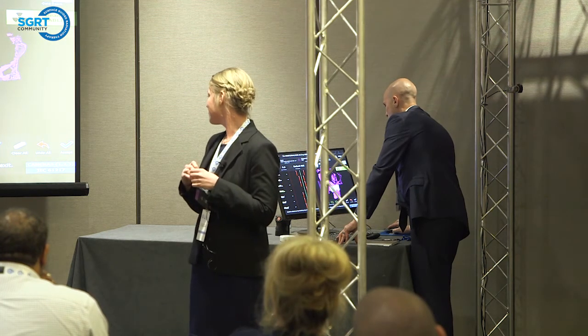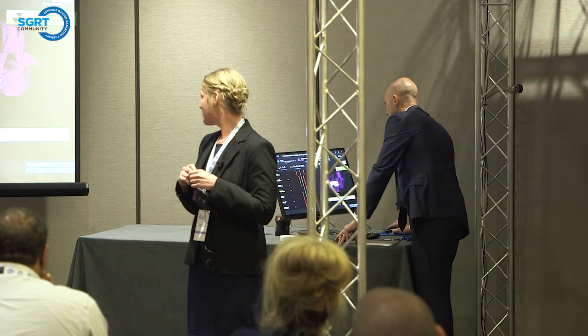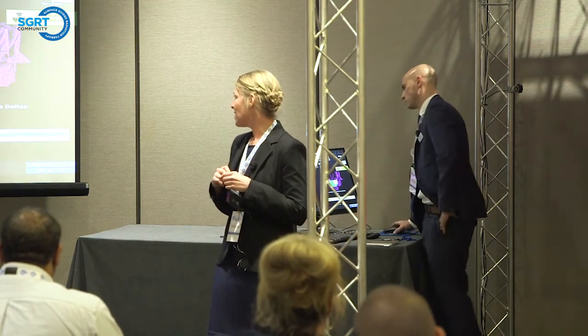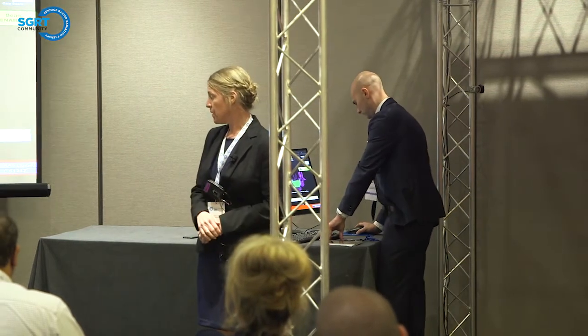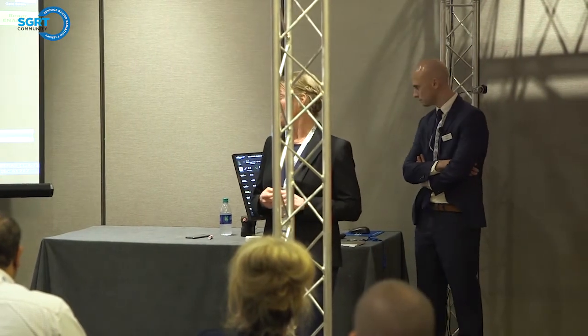Let me fix that region of interest really quick, just following my region of interest rules. Just make sure that everything looks okay. Okay, so next we want to start our monitoring. We'll run our monitoring session, and then we want to align our patient until our deltas are close to 0. If I did need to manipulate my patient, I would start with my rotations first. So I would get the rotation, the roll, and the pitch as close to 0 as possible, and then I would do my translation, so the vert, lunge, and lat.